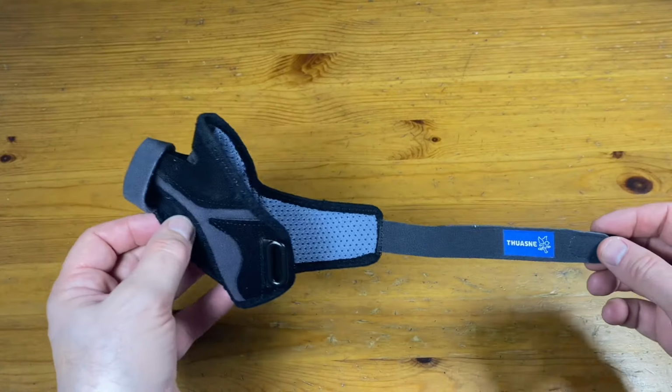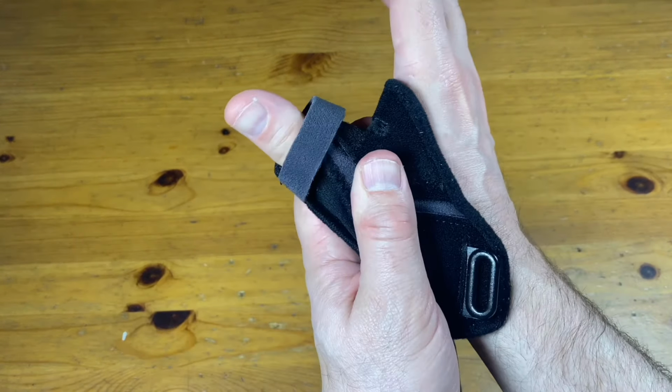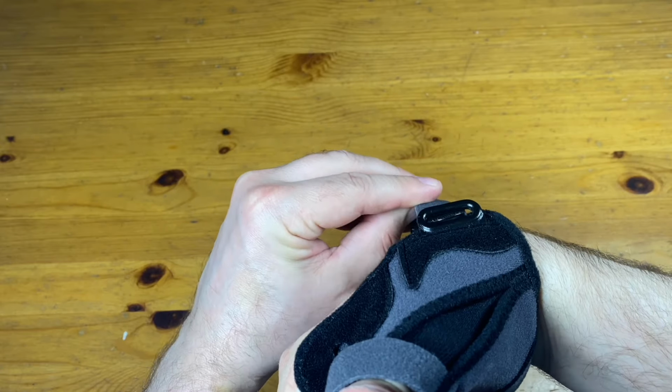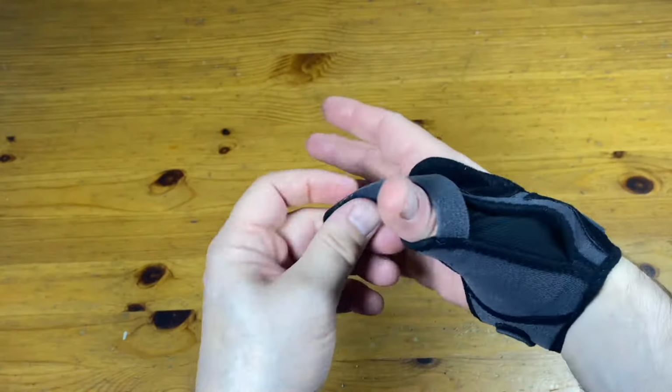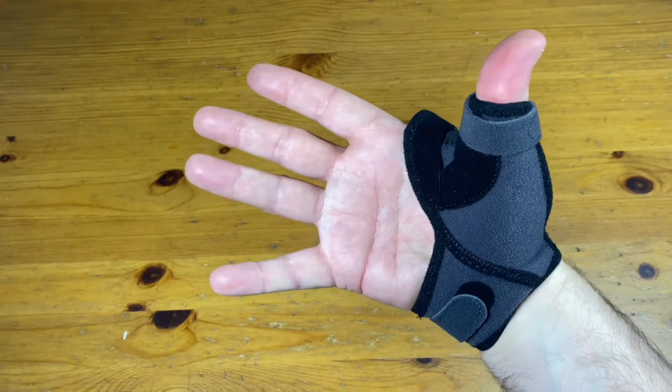So this one is again made mainly of fabric, but it has a plastic wedge that separates the thumb from the index finger. It goes on like this and again is secured with a wrist strap and a thumb tip strap. It's a bit more compact than the last one, and it's also more hard wearing.